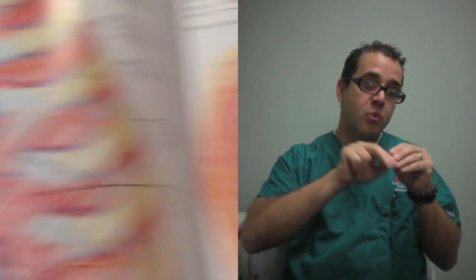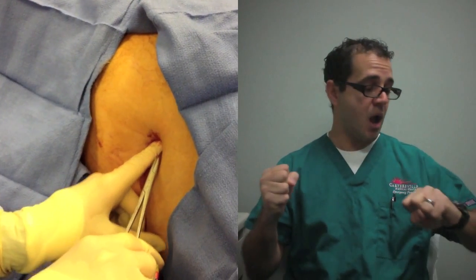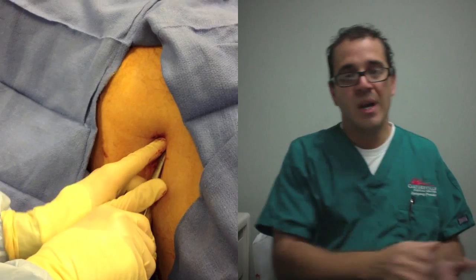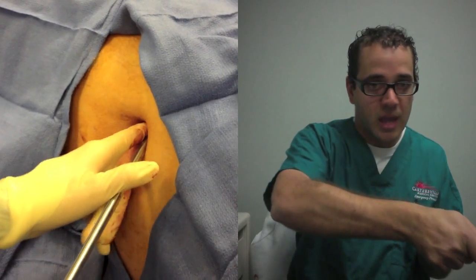You dissect through until you feel your rib space. You want to go right above the rib. If you look at this picture from Netter, the neurovascular bundle — the artery, the nerve, the vein — are underneath the rib. So if you put your chest tube right underneath that rib, you can nick the artery and cause severe bleeding, or nick the nerve and cause peripheral neuropathy. So you don't want to do that — you want to go right above the rib. Some kits have a trocar, which is a big hard metal wire you use to actually stab through, then remove the guide wire. The older method is blunt dissection: you take forceps, put them into the hole, open up until you get to the muscle layer, pop through the space, open it up, and then keep your finger in to save that hole. Then you take your chest tube and push it through into the chest cavity.